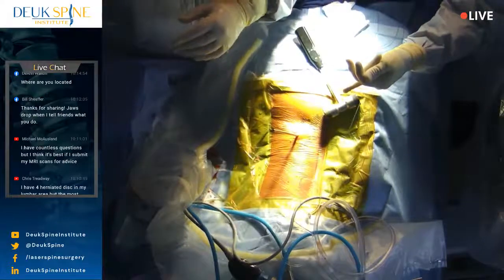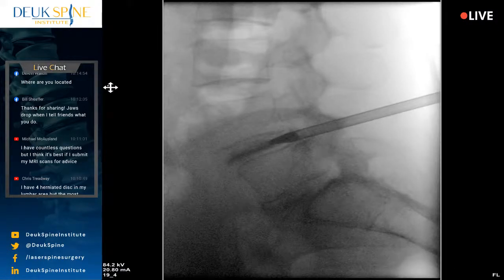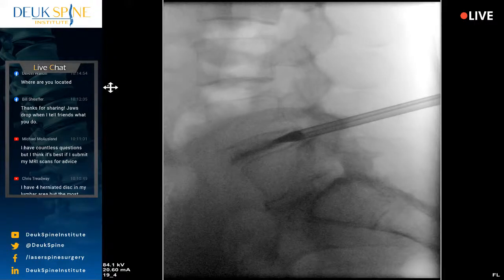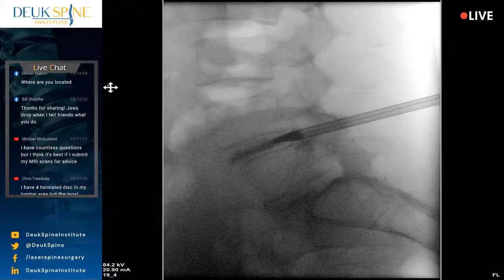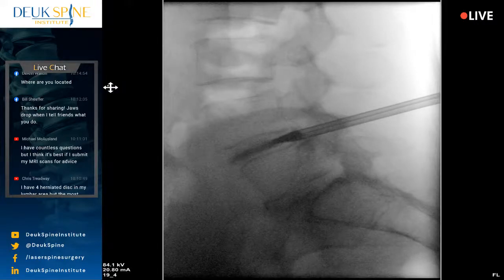Sean. Let me have that. I can't see the guide wire. Sean, do you see it? Maybe that's it right there. You see it now, right? Why are we having trouble? Are you pulsing? Yes, sir. Take it off pulse for a minute. Let's see what's going on. All right, that's better. Let's go with an AP view. And just be careful with the guide wire.